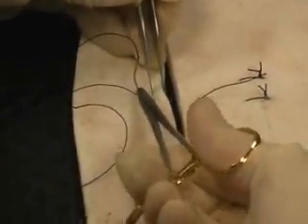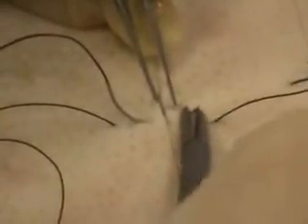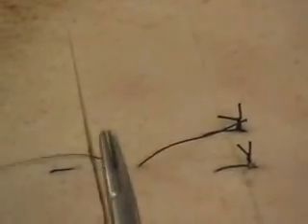The idea here is we're going to go near, near, so we're going to be very near the wound edge. Sometimes you can take this one in one bite because it's fairly small. And we're avoiding that tip as best we can there. Okay, so we went far away from the wound edge to far away, then we went near to the wound edge and came out near to the wound edge. And you notice the near was much more superficial and the first one was much more deep. So you're actually closing 2 layers and you're avoiding dead space. So again, a very deep wound, this would be a good stitch for that.